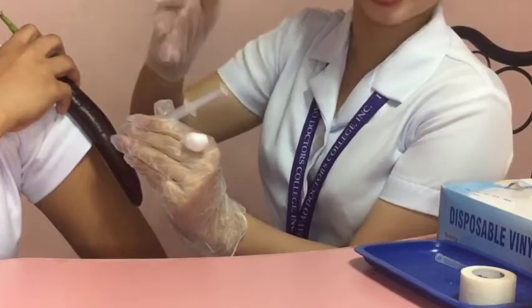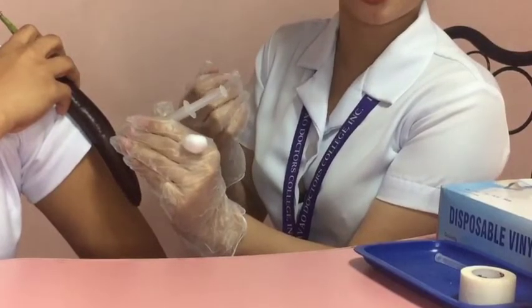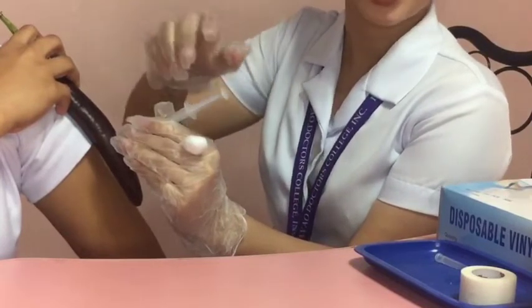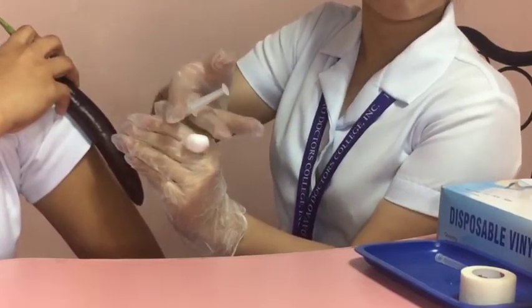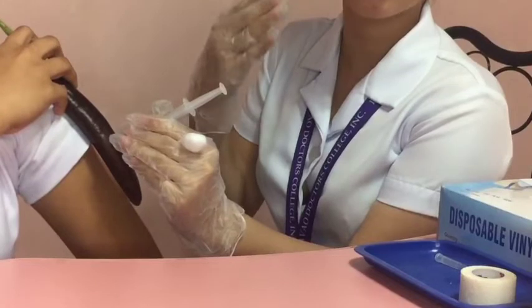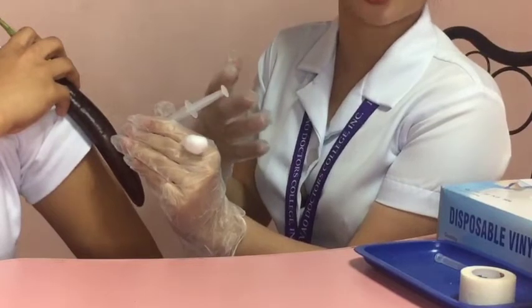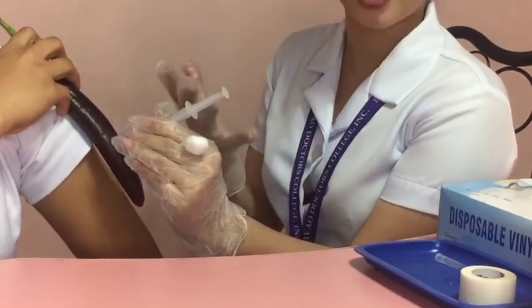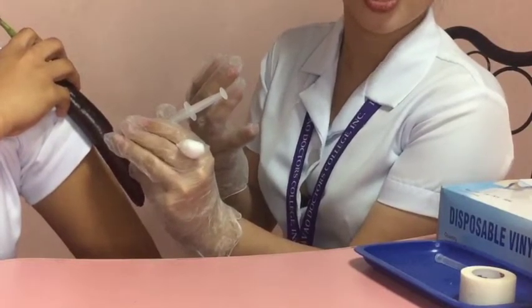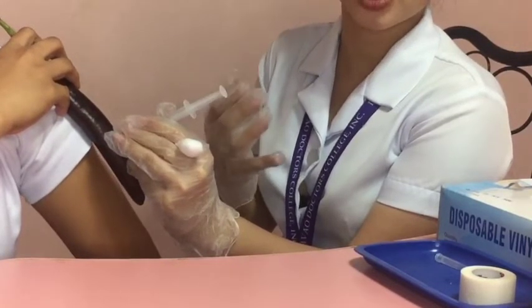If blood appears in the syringe, withdraw the needle, then discard the syringe and prepare anew. If blood doesn't appear, inject the medication steadily and slowly while holding the syringe steady. Injecting the medication slowly promotes comfort and allows time for tissue to expand and begin absorption of the medication. Holding the syringe steady minimizes discomfort. After injection, wait 10 seconds if using a ventral gluteal site.